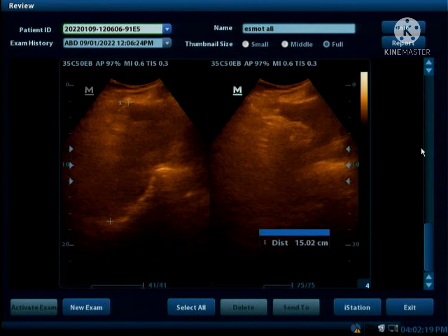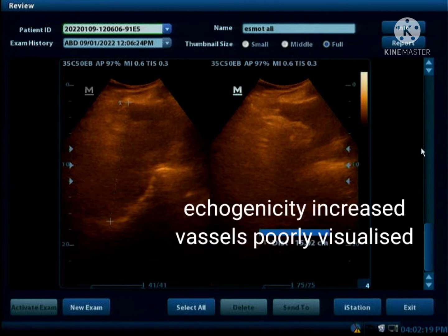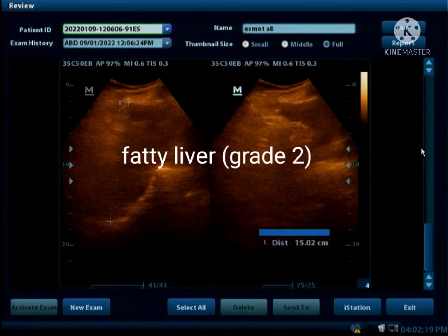Here we can see that the liver parenchyma is moderately hyperechoic and hepatic vessels are not well visualized, so this is a Grade 2 fatty liver.